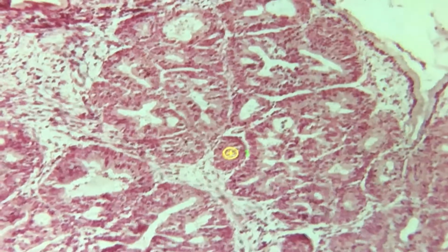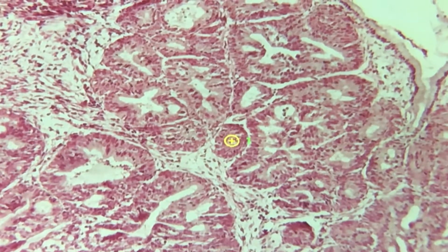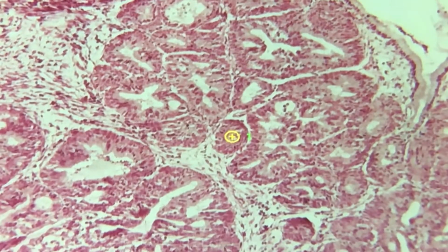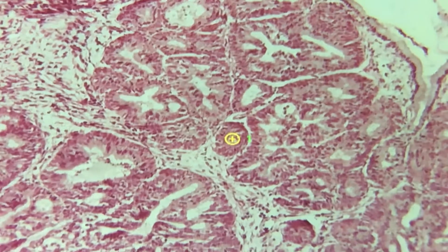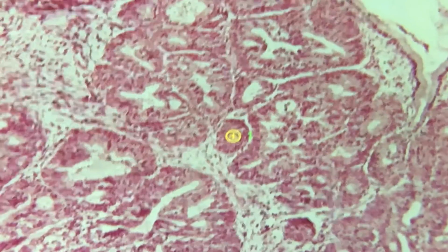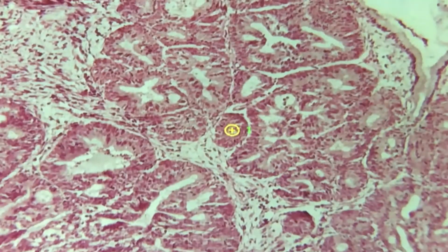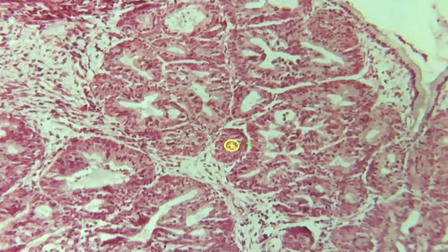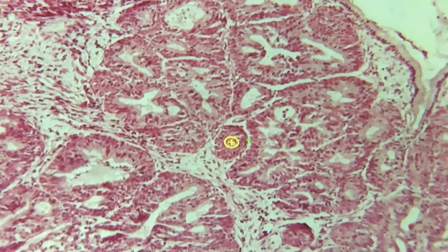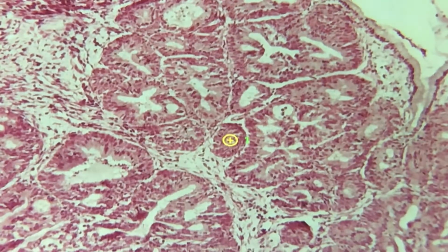It's very important that you detect squamous metaplasia because the management would be different if you just say endocervicitis without squamous metaplasia versus with squamous metaplasia. All the more if you can find atypia, you have to resect that uterus because that atypia sometimes could change into malignant transformation. But here, I think we don't have any atypia.